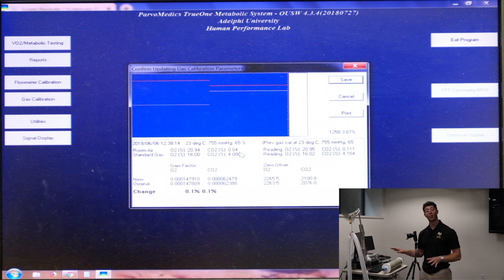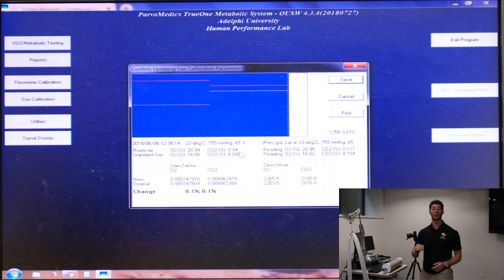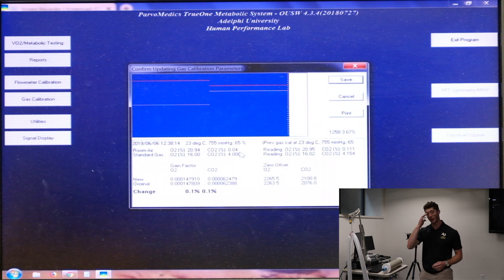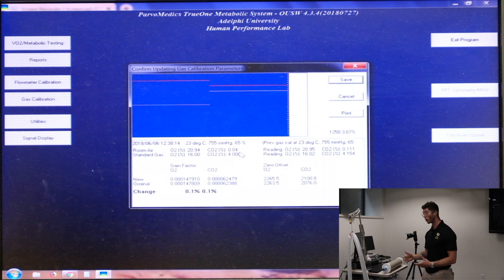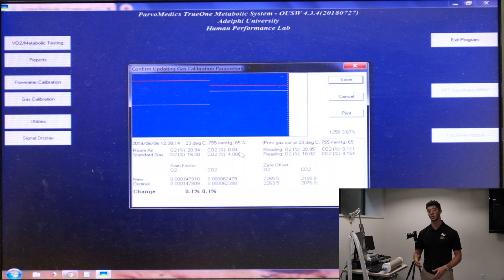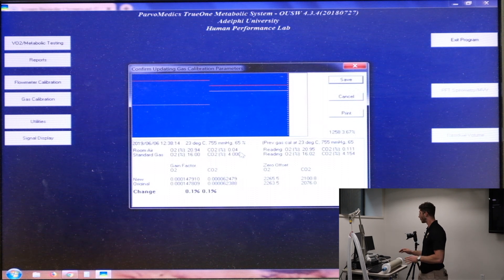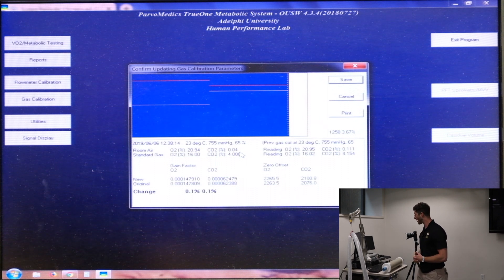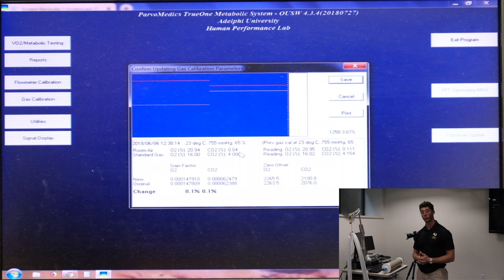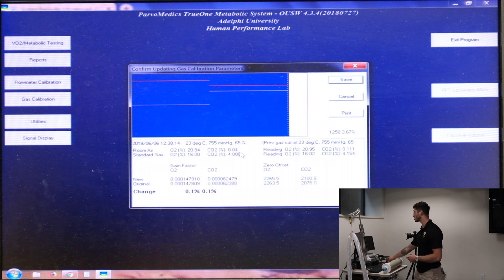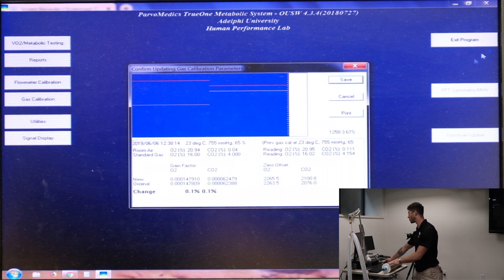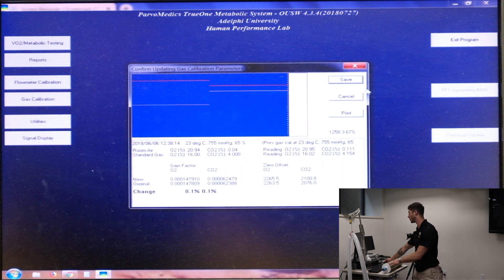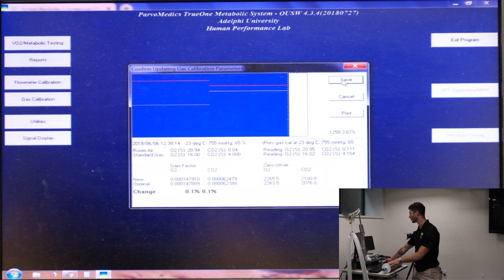If those percentages are astronomical, you know that you have a hardware issue or a software issue and you need to troubleshoot that. But for now, we're all good with our calibration and we can get started with the next calibration, which is the flow meter calibration after we hit save.